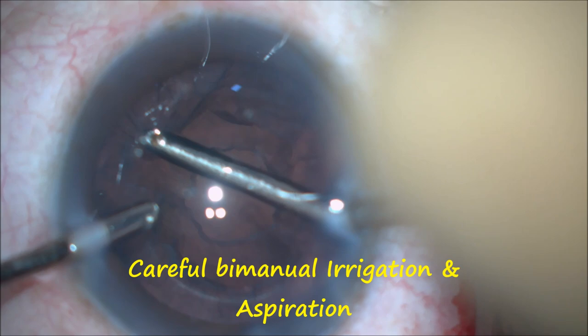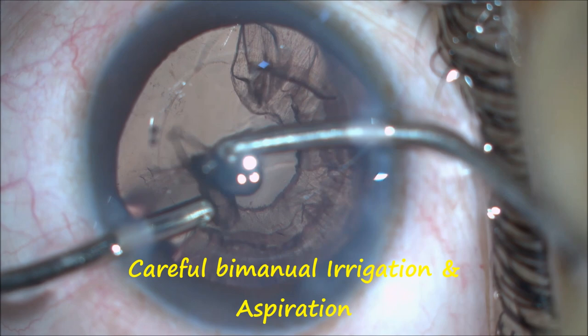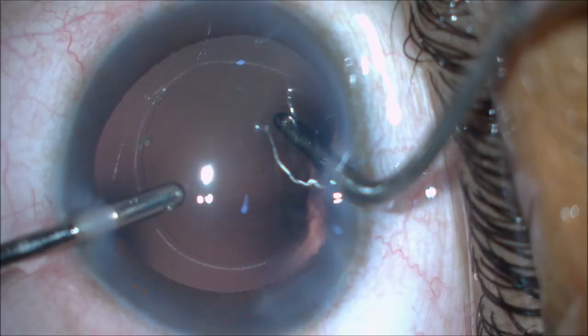A careful bimanual irrigation and aspiration is done slowly and in a circular fashion.